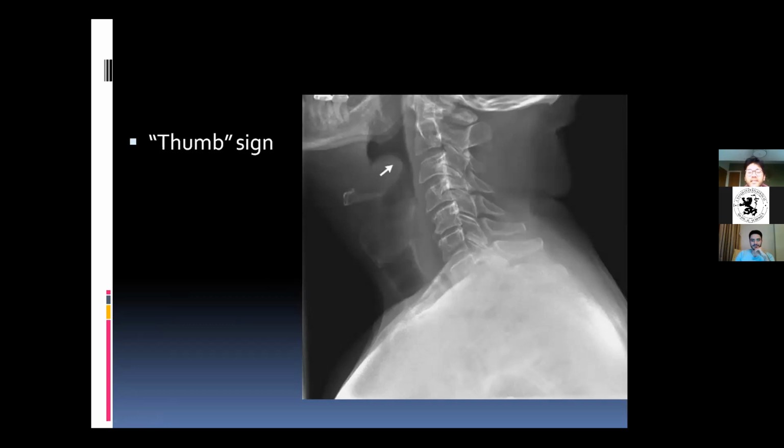Now, why is this an emergency? Why is this more of an emergency than the croup? Does anyone know? Yep, it's definitely more inflammatory. Okay, fine. But why is that? Yeah, exactly. It is fast progressive. Yeah, it's very, very progressive. And why is it? There you go. It is acute respiratory failure that is life-threatening, because you can essentially seal off the entire airway, and that will just result in complete respiratory failure.